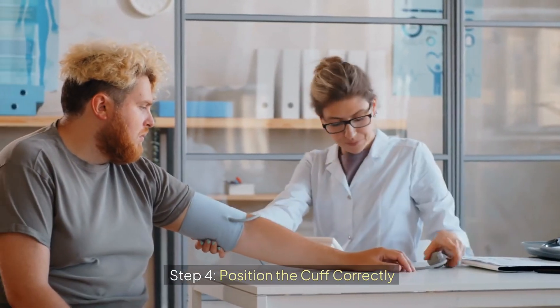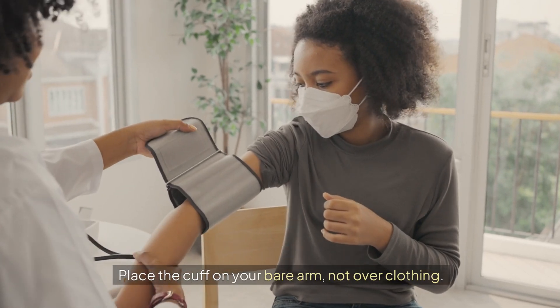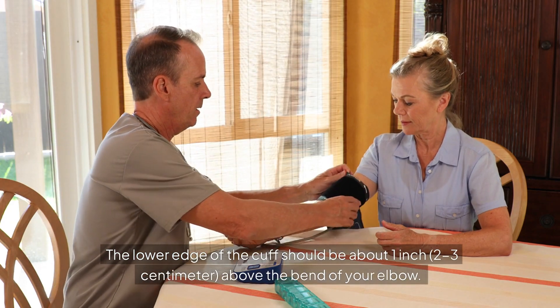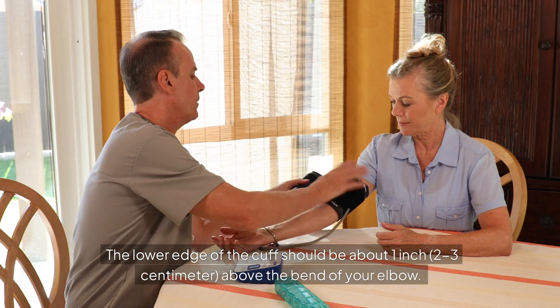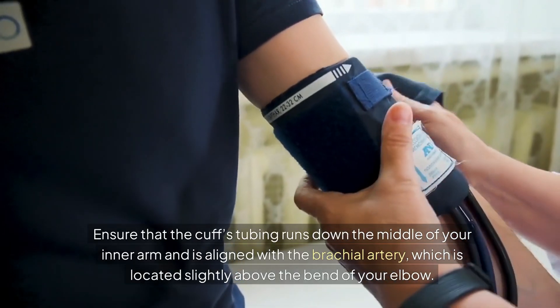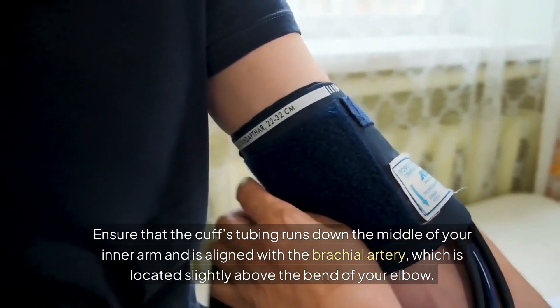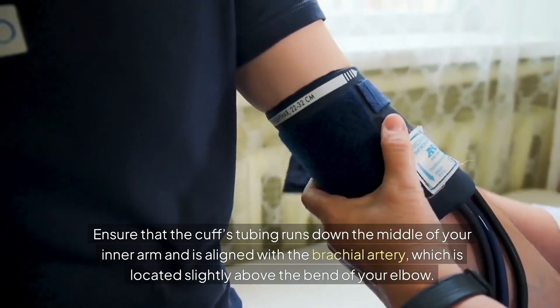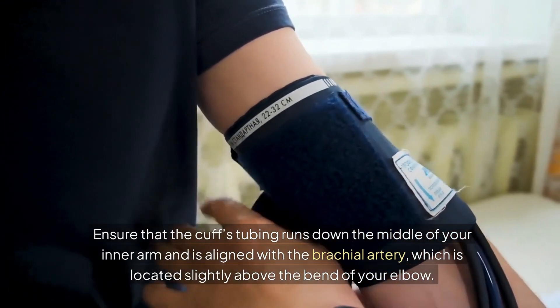Step 4: Position the cuff correctly. Place the cuff on your bare arm, not over clothing. The lower edge of the cuff should be about one inch — two to three centimeters — above the bend of your elbow. Ensure that the cuff's tubing runs down the middle of your inner arm and is aligned with the brachial artery, which is located slightly above the bend of your elbow.